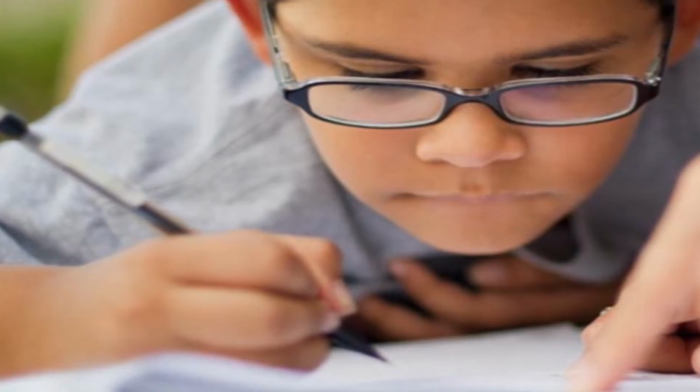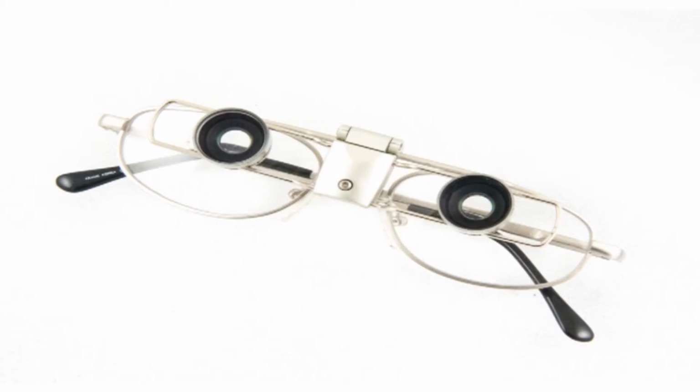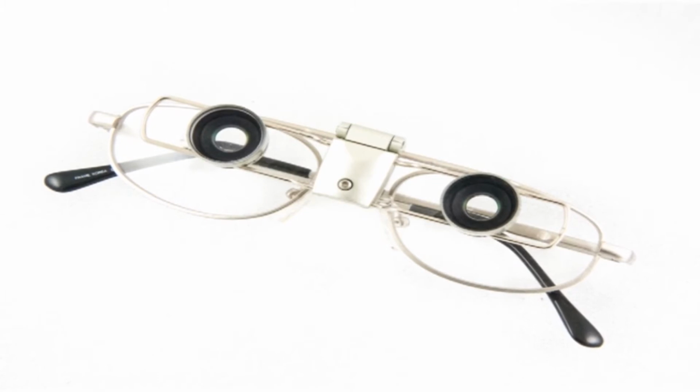Hands-free use can help students to take notes in class more quickly and easily. Some bioptic users prefer telescopes in both eyes, while many users with low vision choose to have only one mounted telescope for their dominant eye.